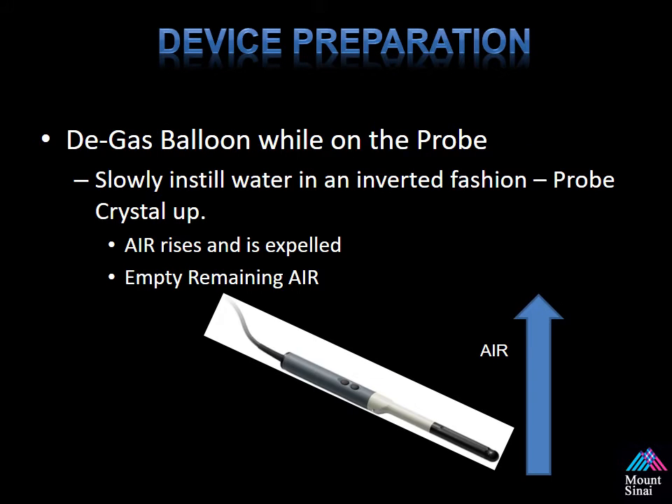The next step is to degas the balloon. We do this in an inverted fashion as well, except this time with the crystal up, because the balloon hub where the connecting tubing attaches to the endocavity balloon is on the anterior surface. This is the way you can expel all the air, and it's very important because this can affect your imaging quality.